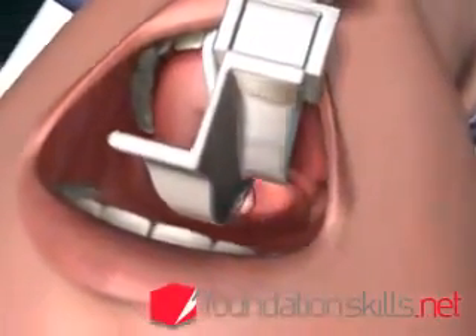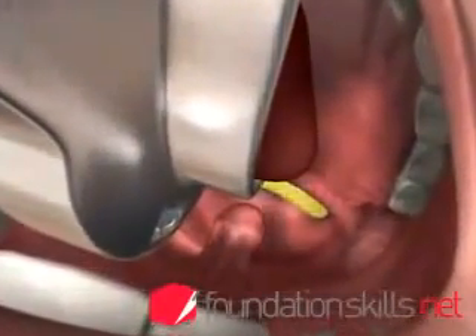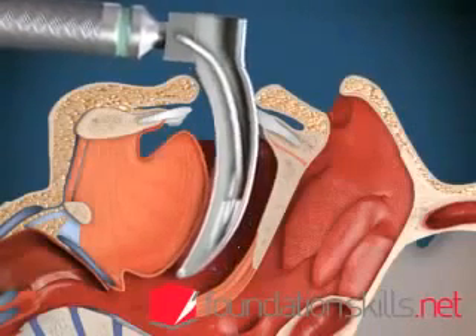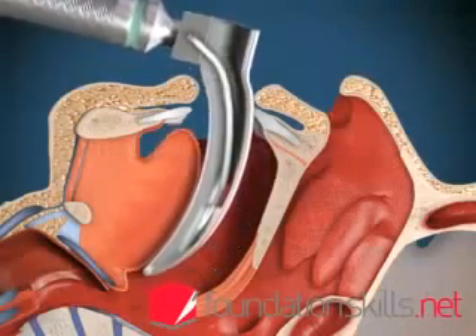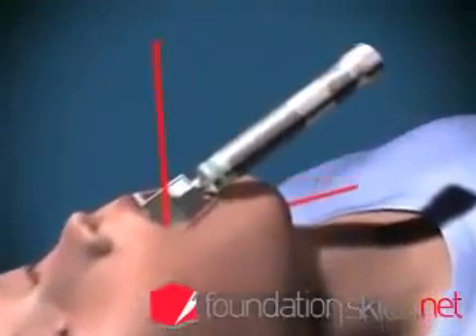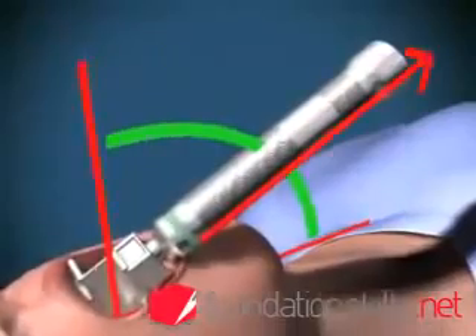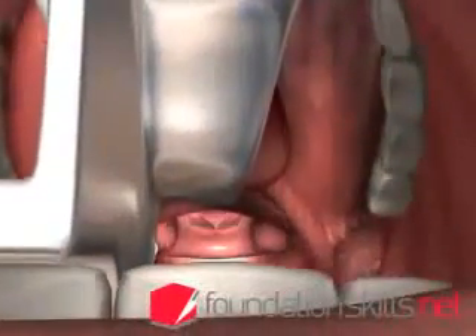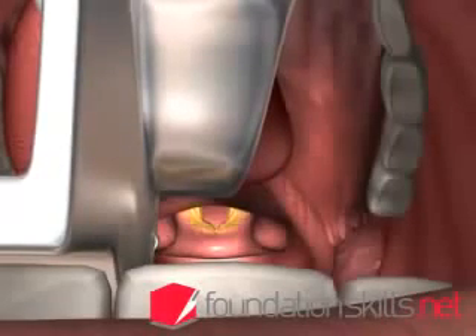Advance the laryngoscope slightly until the tip of the epiglottis can be seen posterior to the back of the tongue. Advance the tip of the laryngoscope blade into the vallecula between the epiglottis and the tongue. With the handle of the laryngoscope pointing away from you at 45 degrees, lift upwards and away to lift up the tongue and epiglottis to display the vocal cords and the laryngeal opening.